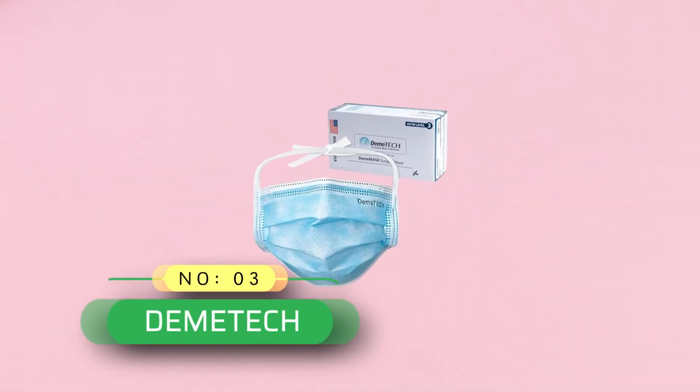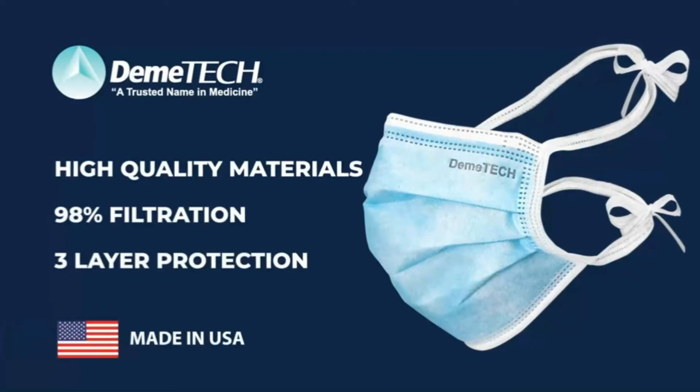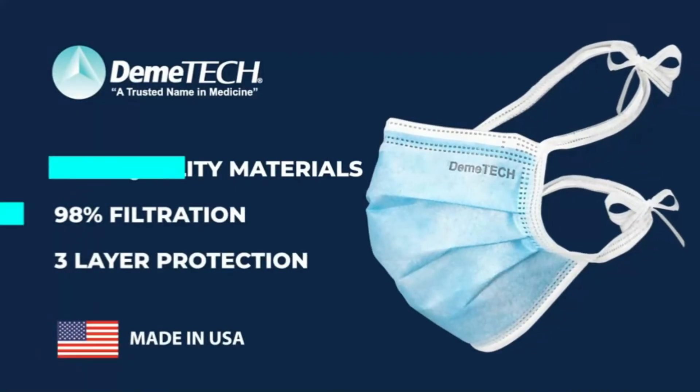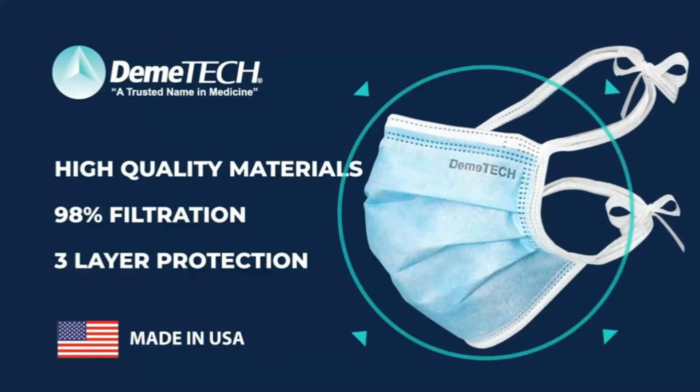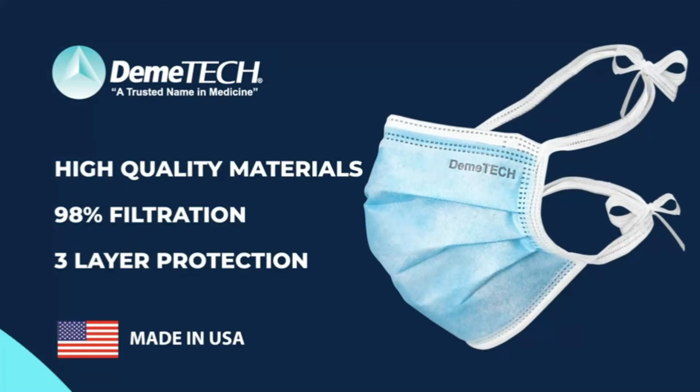Number 3: Deemtech ASTM Level 3 Surgical Mask Made in USA. Each American-made ASTM Level 3 mask uses only the highest quality materials. This thin horizontal tie face mask ties over and under your ears to secure the mask to your face, with three layers of protection.